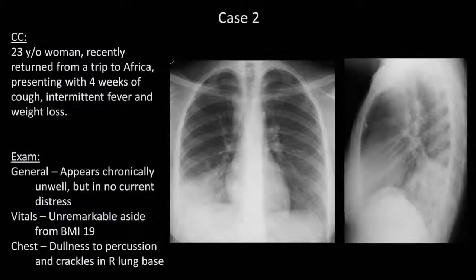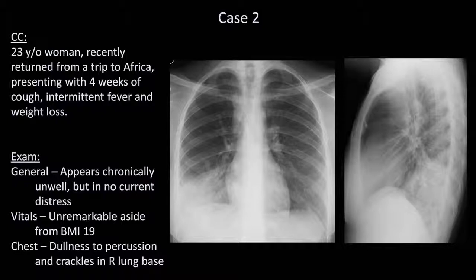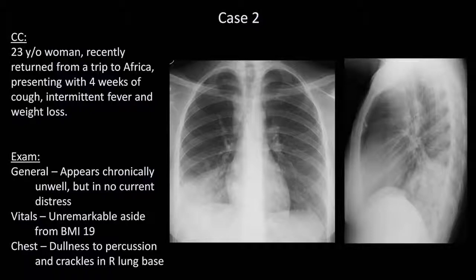Case 2. A 23-year-old woman, recently returned from a trip to Africa, presents with 4 weeks of cough, intermittent fever, and weight loss. The first thing you probably noticed was the dense opacification of the right lower lung field on the PA film. Examining the lateral film, we see that the patient has an opacity in the inferior posterior part of the lung. Thus, this opacity is in the right lower lobe.